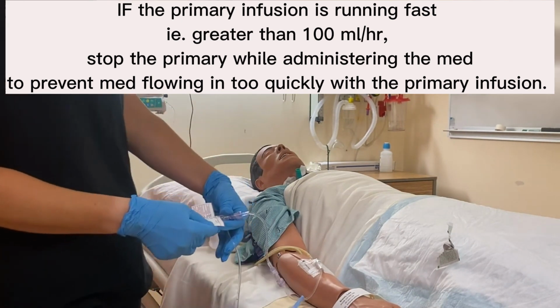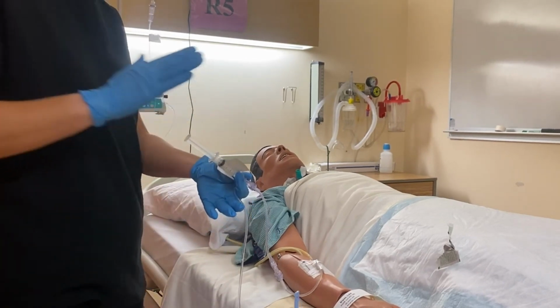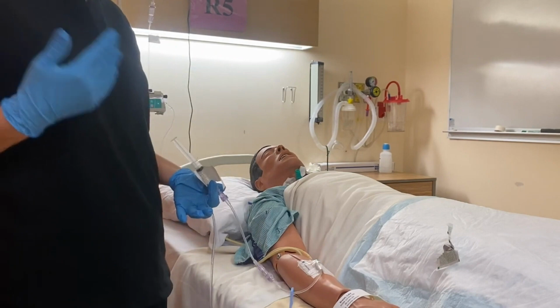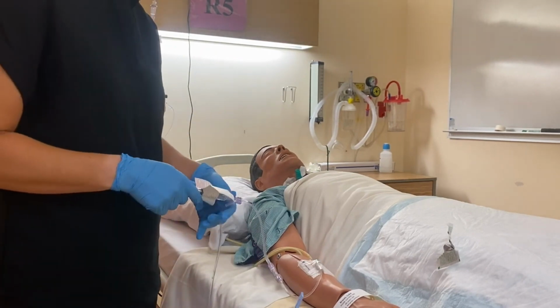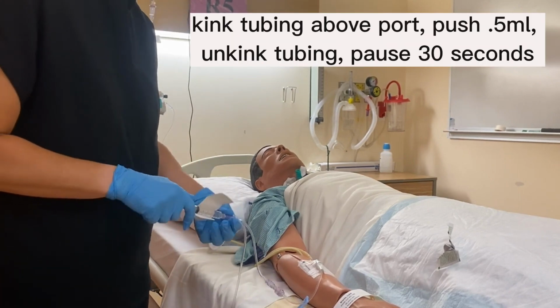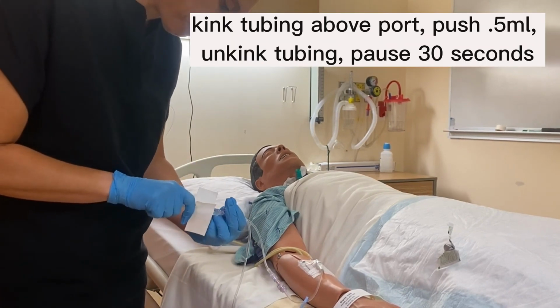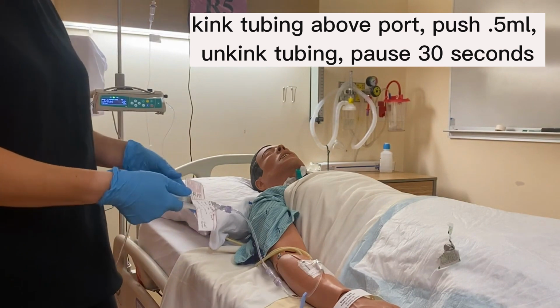Now, I wrote on my label, it reminded me how fast I can push this. I don't want to just slam it all in, because then they get 5 milligrams of morphine all at once, which could be detrimental to them. So I'm going to kink the tubing, and it says 0.5 mLs every 30 seconds. So looking at my titrations, I'm going to push in 0.5. And then I'm going to pause, unkink the tubing for 30 seconds.